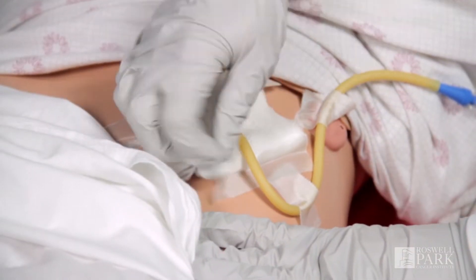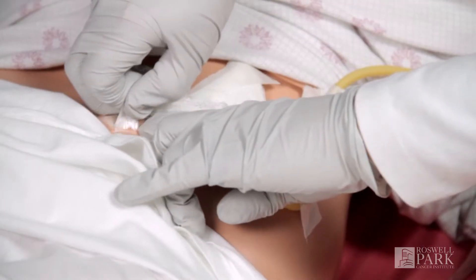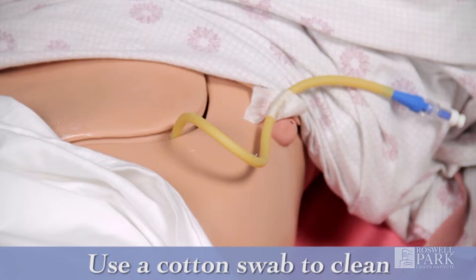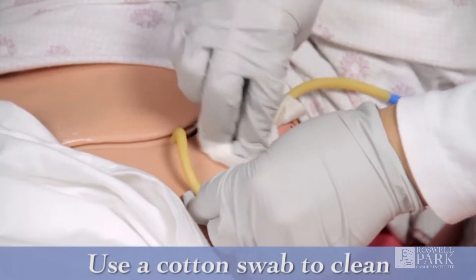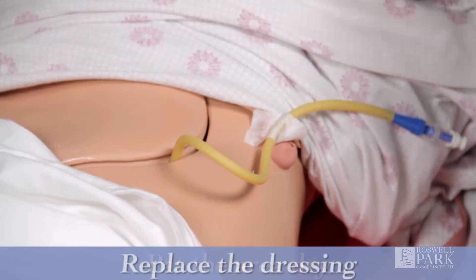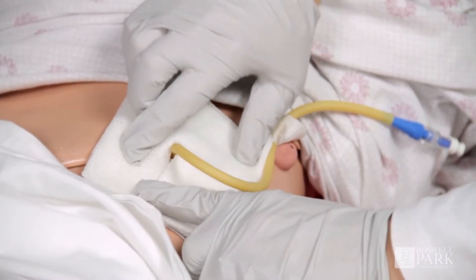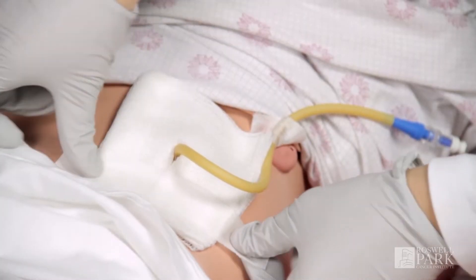Remove any dressings and throw them away before cleaning. It's important to clean the skin around the tube daily and anytime there's leaking. Use a cotton tip swab to gently clean the hard to reach places. Pat the area dry. Replace the dressing, using the least amount of tape necessary to keep the dressing in place.